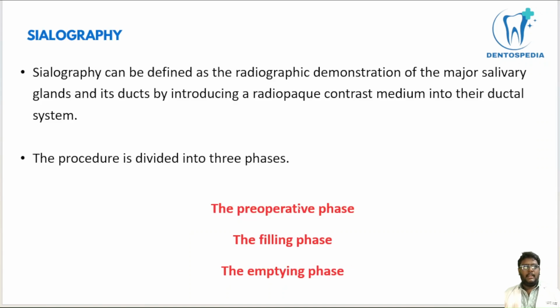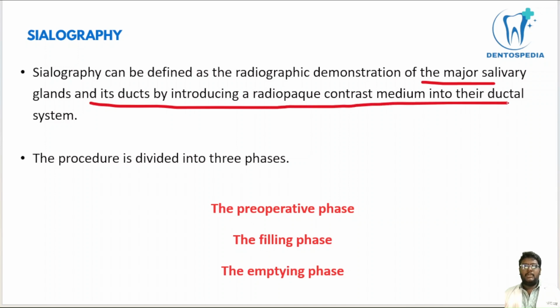Okay, and coming to the next investigation, that is sialography. It is a kind of invasive technique. Okay, this is a radiographic demonstration of major salivary glands and its ducts by introducing a radio opaque contrast medium into the ductal system.